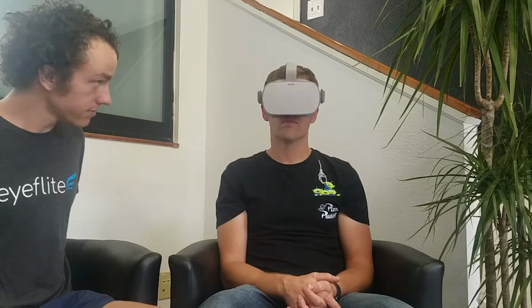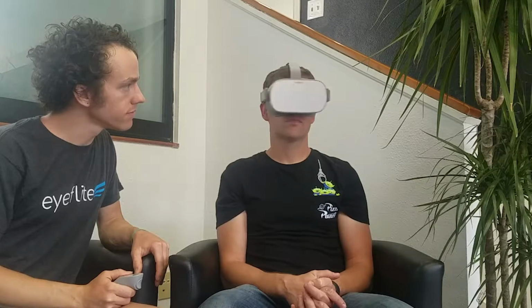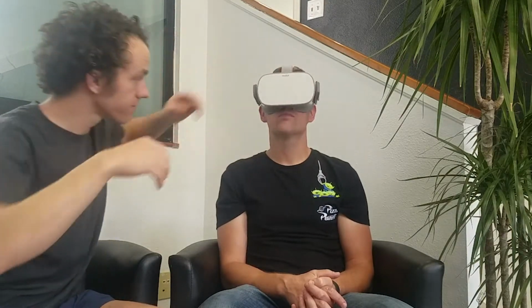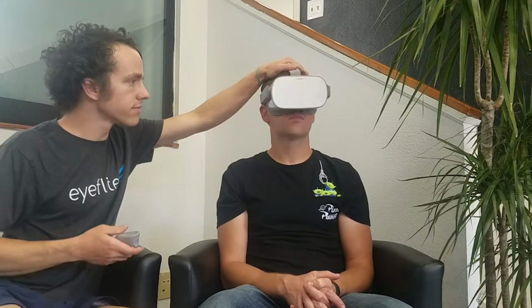If it isn't, press the power button once to wake up the Oculus Go. Be sure to ask the user if they can see the image clearly, and if not, readjust the headset for them. Once the Oculus Go is on the user, position their head facing forward.